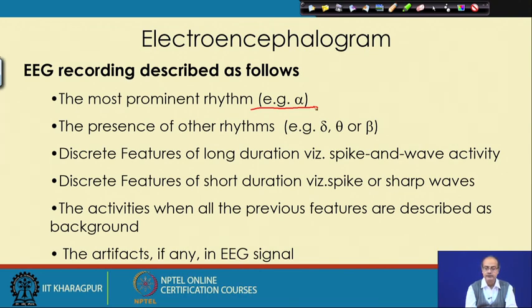Now, the person lying on the bed while we are collecting the data may get into light sleep, and again become awake as the instructions are given. So, there could be the presence of other rhythms, or that person could become busy thinking about some other problem. He is like any other normal person and he has other duties. So, while physically at rest, that person may think about the responsibilities he has to discharge after this session. So, other waves also may come in.